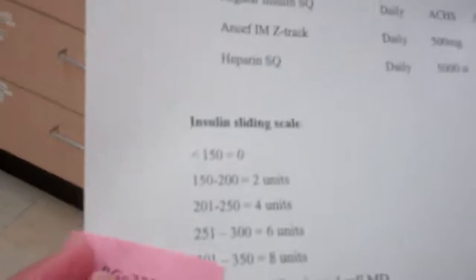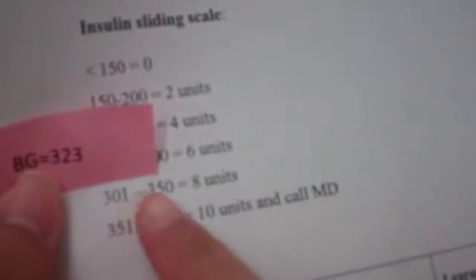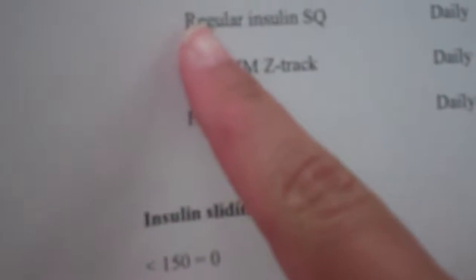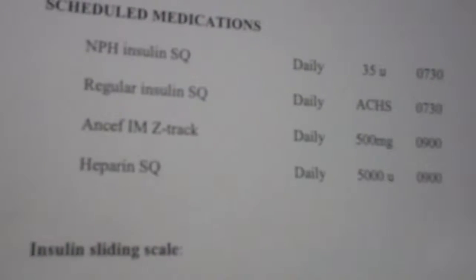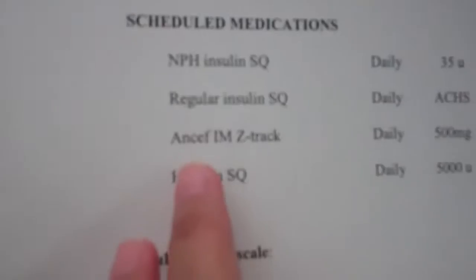My name is Annabel, and I'll be doing the injections, parenteral medications. My blood glucose is 323, so I'll be giving 8 units for my regular insulin. Today I'll be giving my patient David Schumer, who has no allergies, NPH insulin, regular insulin, Ansef, and heparin.